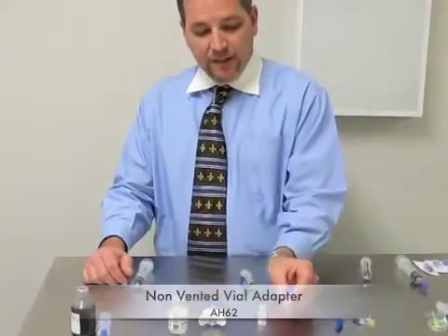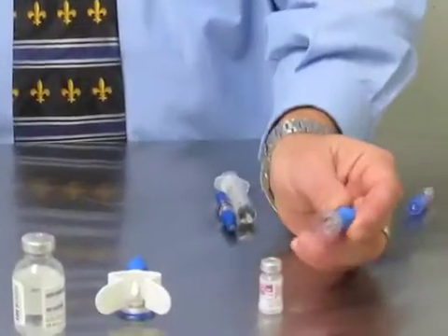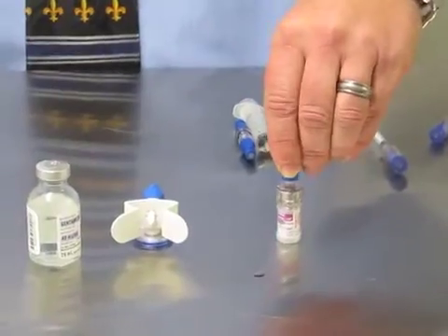Chemoclave utilizes three different vial adapters. The first vial adapter is a non-vented, single-use vial adapter for your smaller vials like Vincristine. Simply place this on there and push it down and it'll lock on.